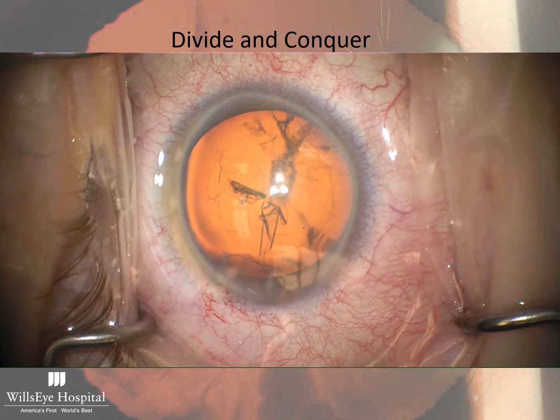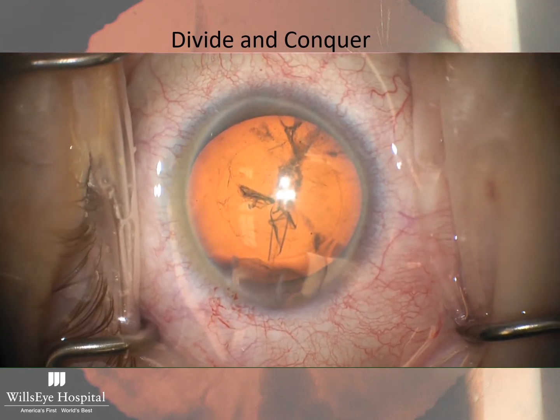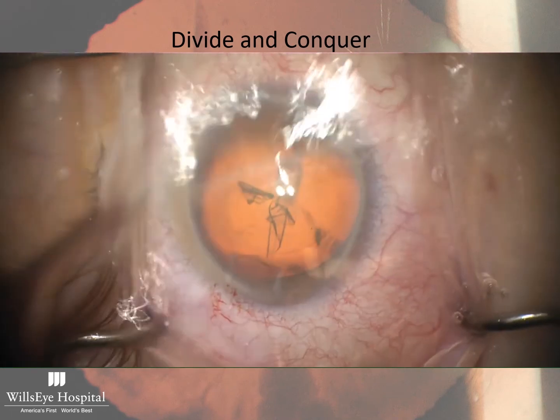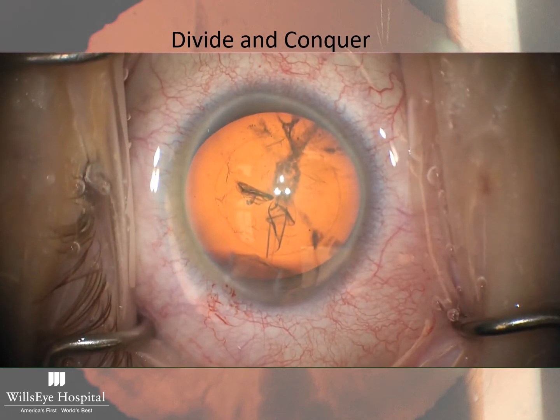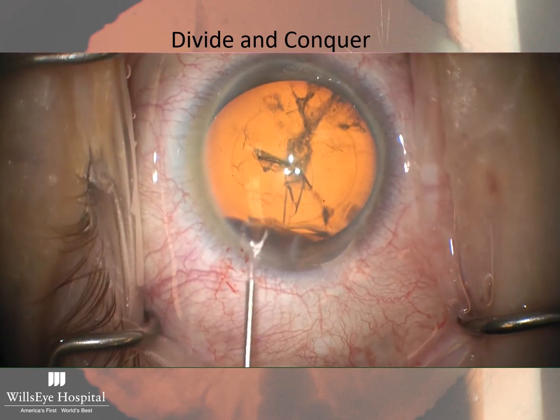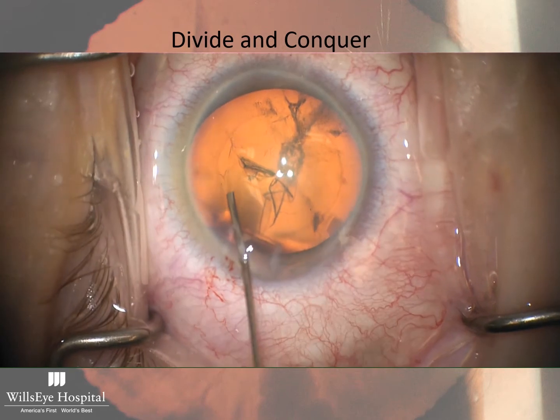There's a little bit of oil secretions on the surface of the eye. So I use the phaco tip essentially over the surface of the eye to disrupt the surface tension. That gets rid of the oil secretions there. Just don't phaco the cornea.